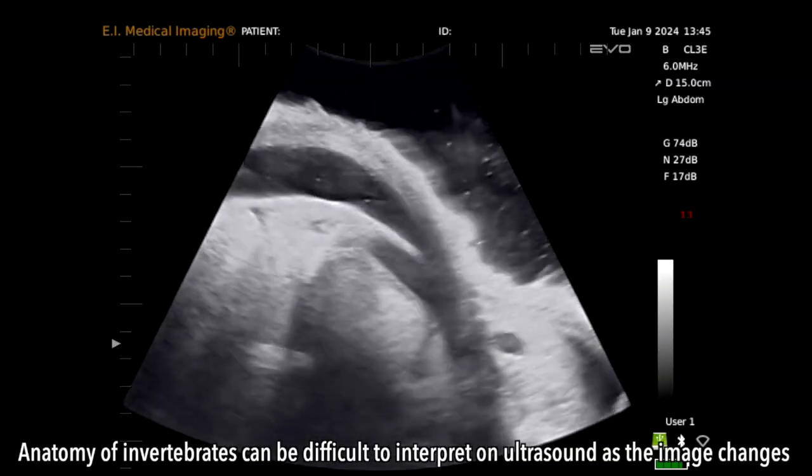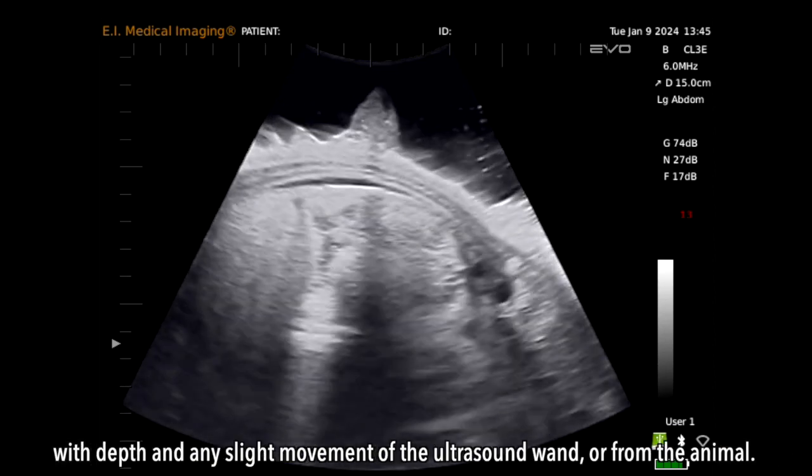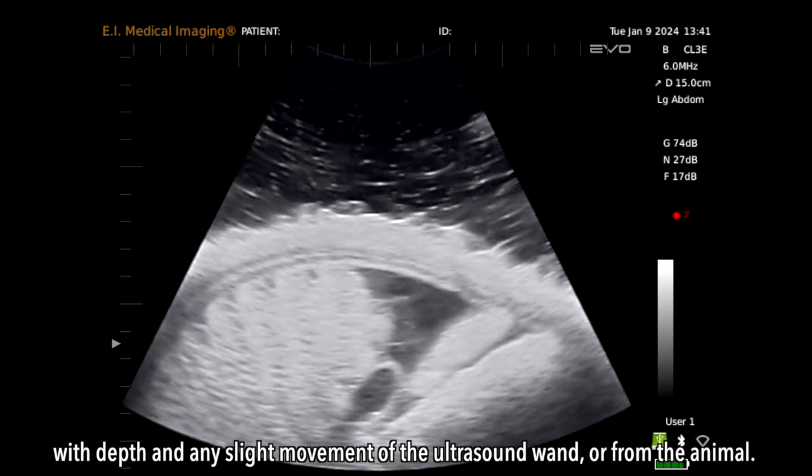Anatomy of invertebrates can be difficult to interpret on ultrasound, as the image changes with depth and any slight movement of the ultrasound wand or from the animal.